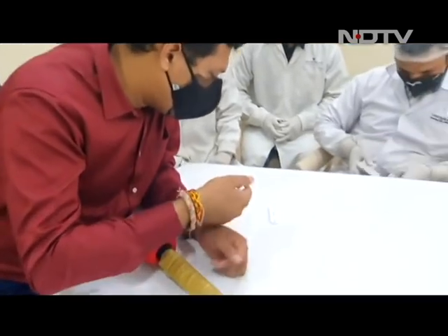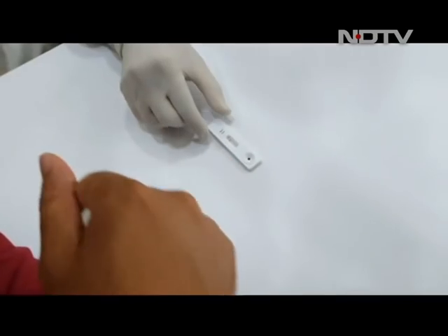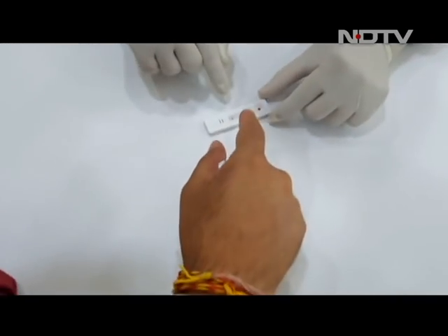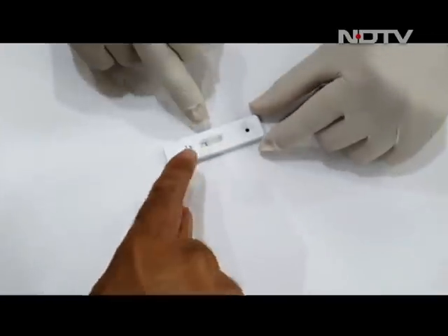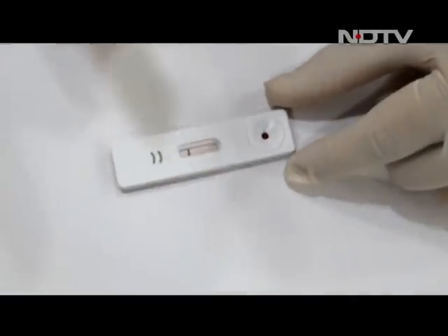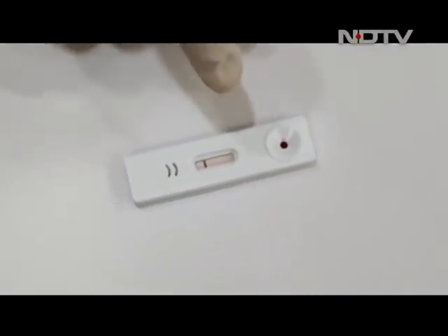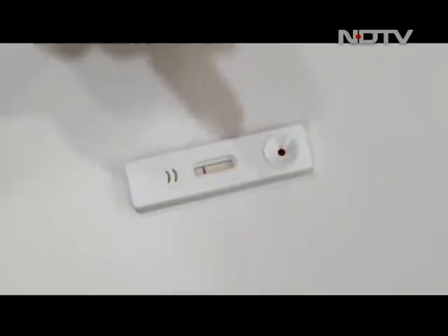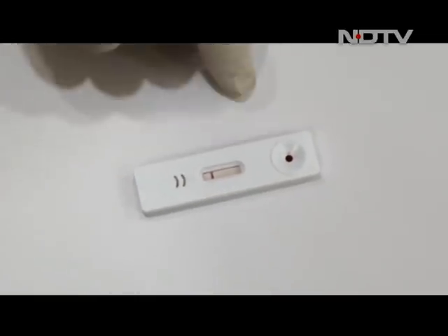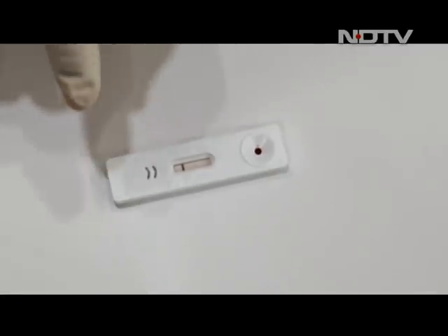So we're done with the test. We take the blood in this dropper, put it in the kit, and then if you see here, this will now show me, and the doctor from Voxter Bio Limited will tell us. So you can explain to me what the result is showing. We can see here only the control line, which means the test is proper. Test is proper, and we can't see a line on second and first. So that means the person is negative for COVID. That person is not infected previously with the COVID virus.